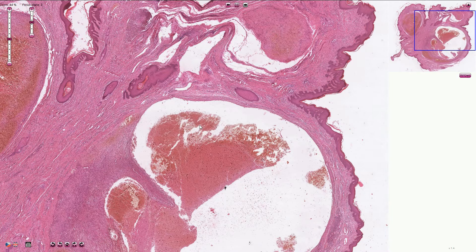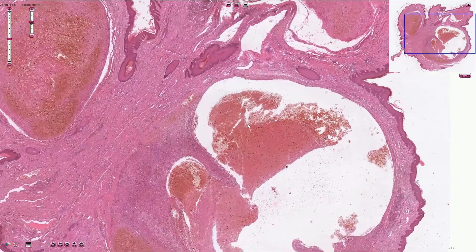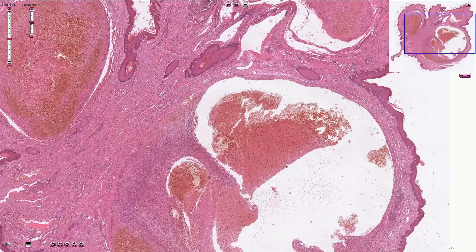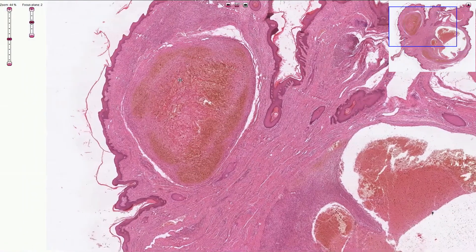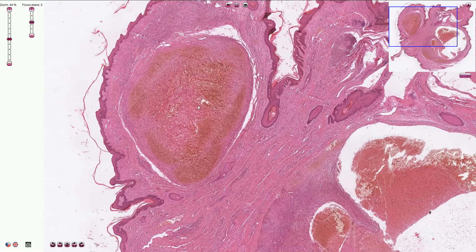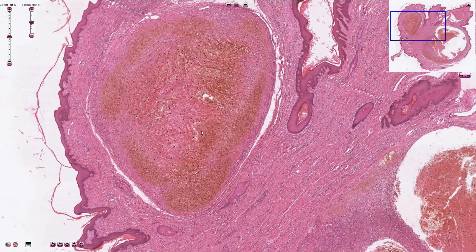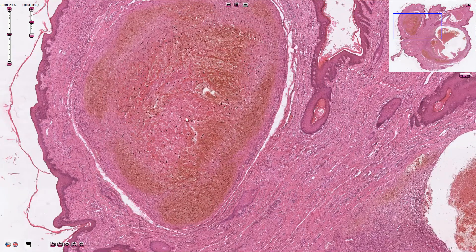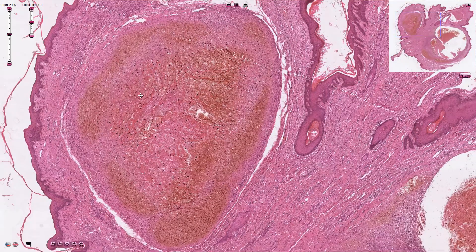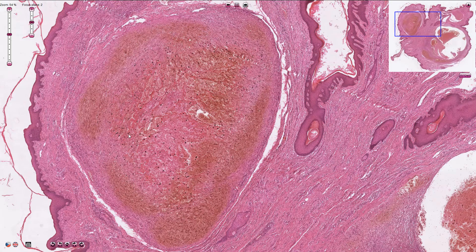The third risk factor is hypercoagulable state — various inherited or acquired conditions like antithrombin 3 deficiency, oral contraceptives, and a bunch of others. In this case, dilation of the veins and stasis of the blood led to thrombosis. Because these thrombi were there for some time, they are already organized. Here we can see the red blood cell areas, and in between are platelets and fibrin. We don't see the typical lines of Zahn because this thrombus is already organized.